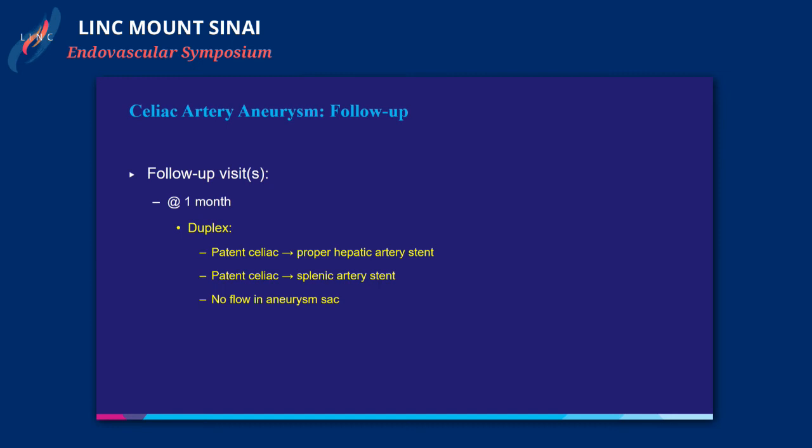You're more worried about seal than patency. He could occlude asymptomatically. We see a lot of occluded celiacs, so that wouldn't be too much of an issue.